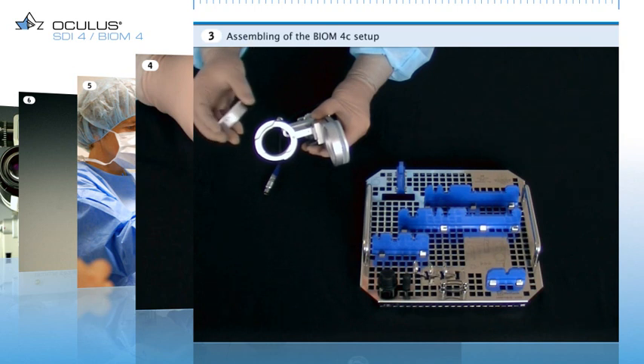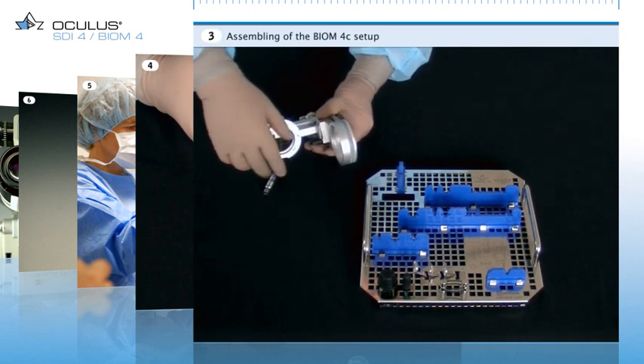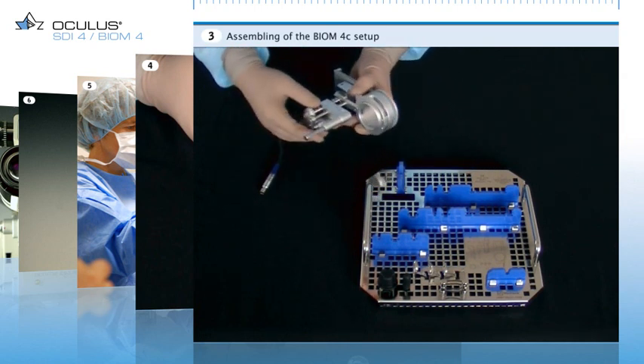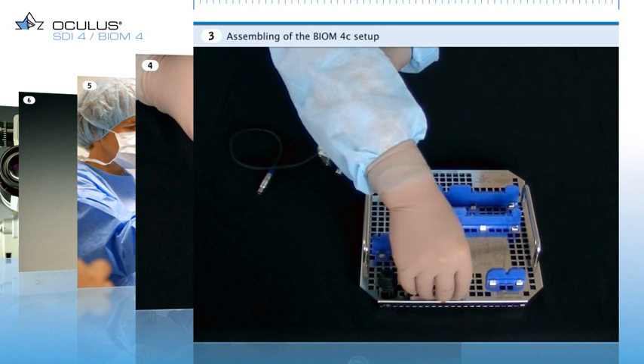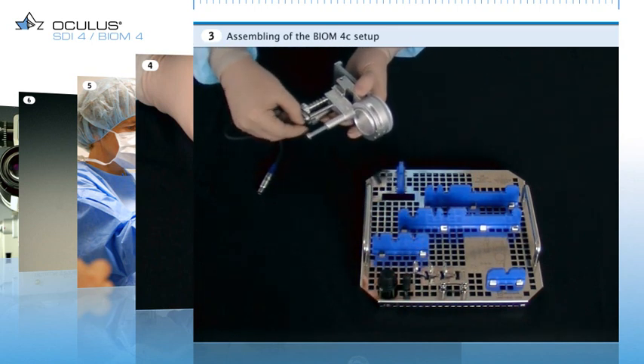Folding the adapter towards the Biome reduces the instrument's dimensions and makes it easier to install on the operating microscope. Turn the focus adjustment wheel on the Biome until the bridge reaches the upper end of its travel. Slip the drive belt for powered focus adjustment over the drive wheel and the two guide rollers.